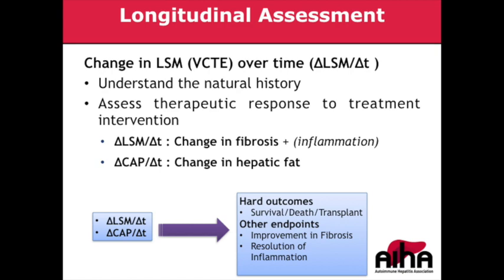For example, a new diagnosis of autoimmune hepatitis. You do the biopsy, there's stage 3 scarring, just our first patient. You got her into biochemical remission, and the stiffness improves. Then a year later, the patient comes back and says, okay, I've maintained my remission, I'm taking this drug, tolerating well, can you tell me if I moved from stage 3 to stage 2? Give me something, I know the enzymes have not been a problem.